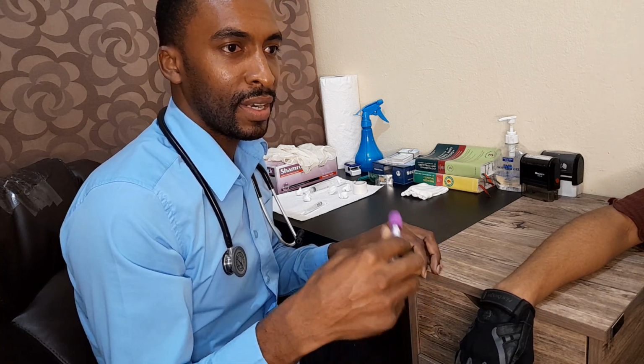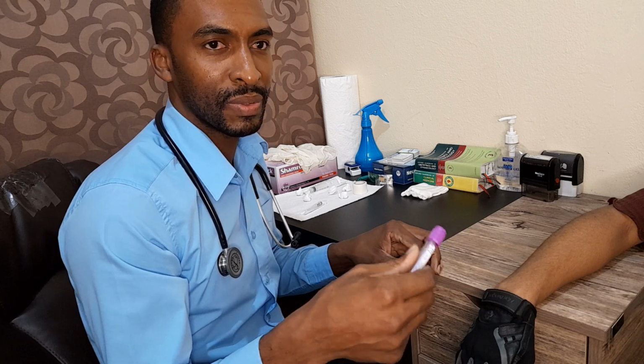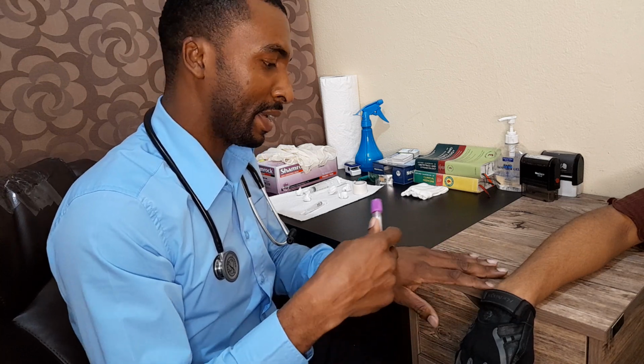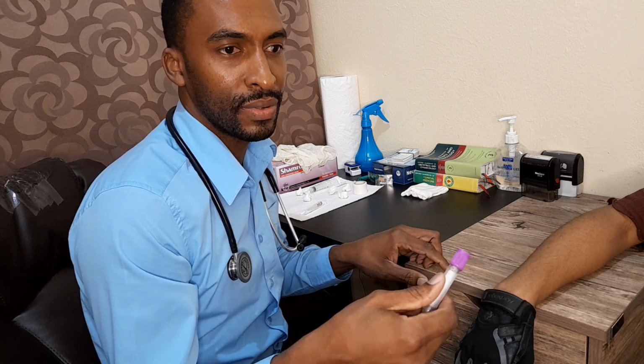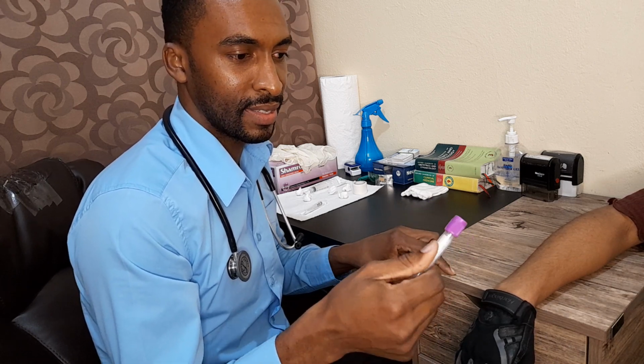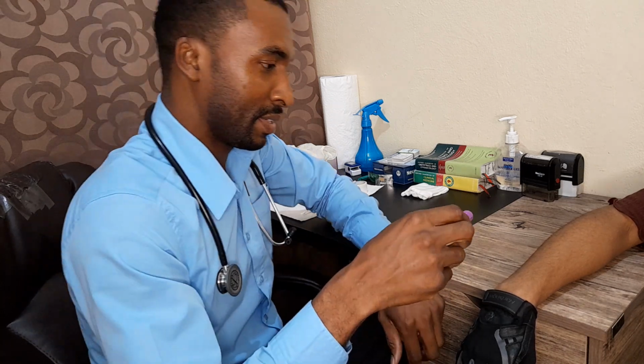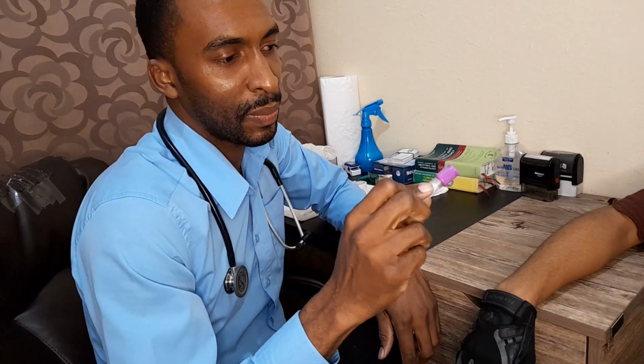All right. Other indications for a complete blood count may be patients that have problems with clotting, like if they bruise easily, have bleeding nose, bleeding gums, or persons that may pass blood in the urine, etc. We also would want to assess their clotting indices, that is the platelets. Also, if persons have infection, the complete blood count, again a purple top tube, is what we use.